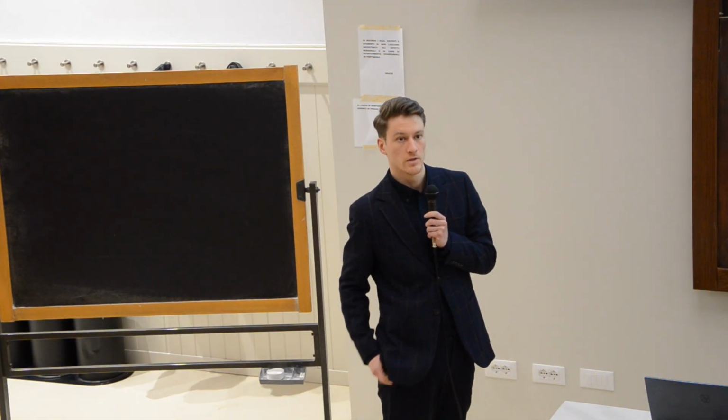Hi, Paul. We know each other for a while. Just more curiosity. So the second part, where I use this feature matching just based on the image. We know muscles among people are really different, and regions maybe can also be similar. Also just by tilting the probe I can probably cheat a bit. Or what if there is actually a change, maybe a massive muscle drop, for training or low gravity, as we talk quite a bit, and your feature score will be really low, but that doesn't mean it's a bad location.